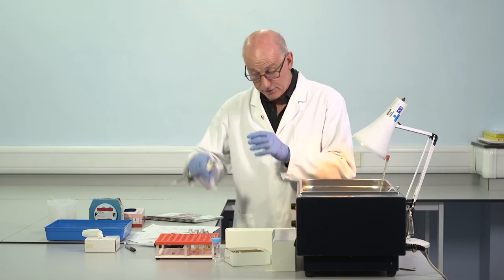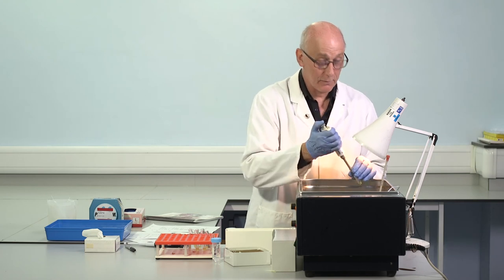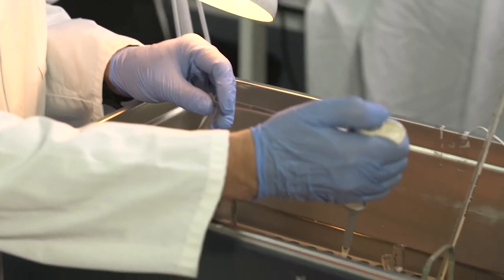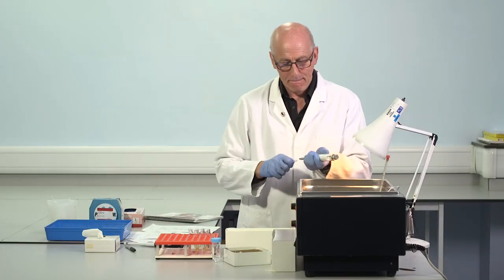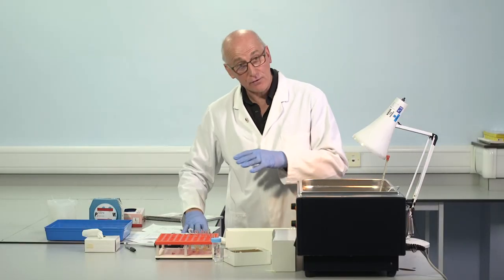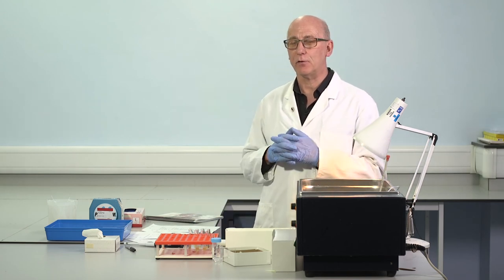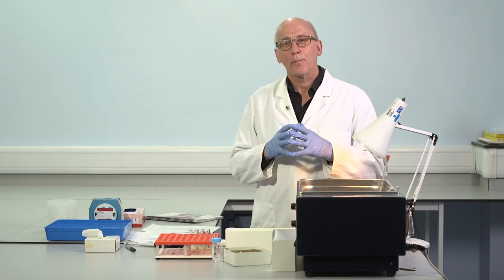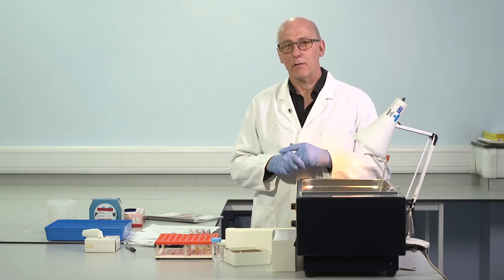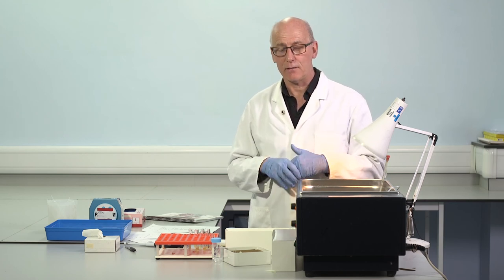Just whilst we're talking about that, I'm going to start number two with the second reagent. We only have a few more tests. Bear with us. So these two reagents, clearly prolonged result, 30 international units per deciliter. Actually, it was 29 in this patient, I remember. These are sensitive reagents in relation to factor VIII deficiency, mild haemophilia.